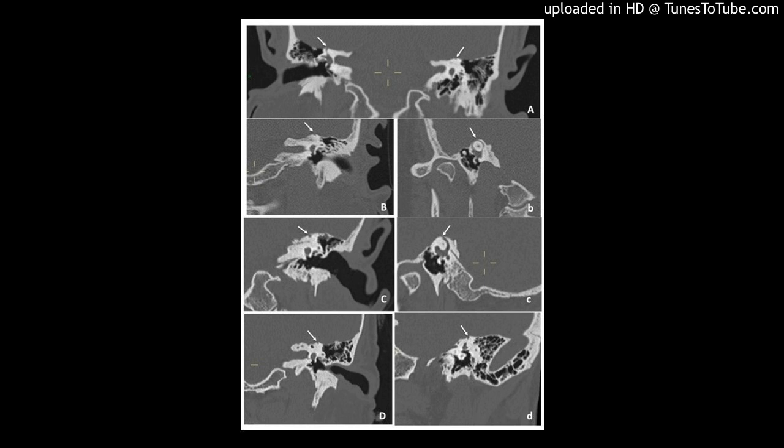Short discussion. The trend in the surgical management of SSCD has recently been in favor of the transmastoid approach over the middle cranial fossa approach. This is due to the procedure having a good safety profile, equivalent efficacy and shorter hospital stays in comparison to the middle cranial fossa approach. Furthermore, as the middle cranial fossa approach involves brain retraction and dural exposure, the potential for serious complications is higher.